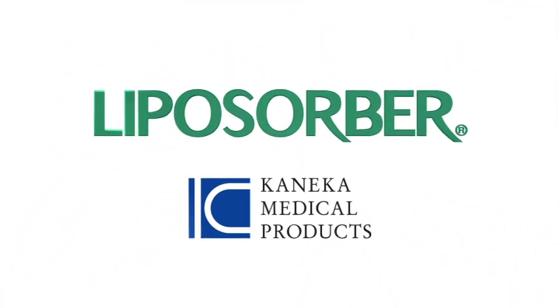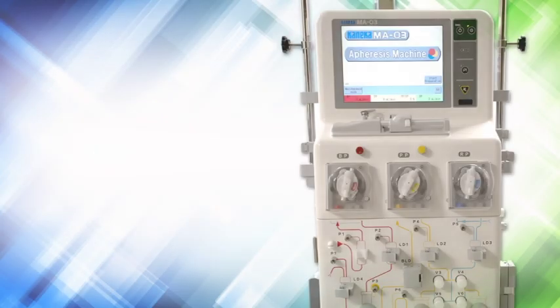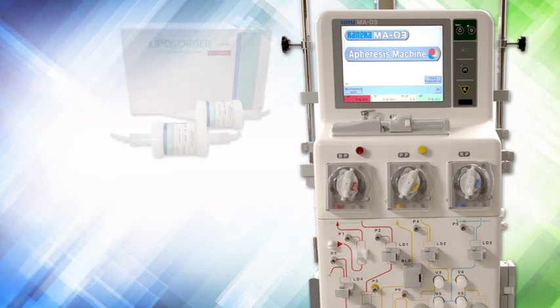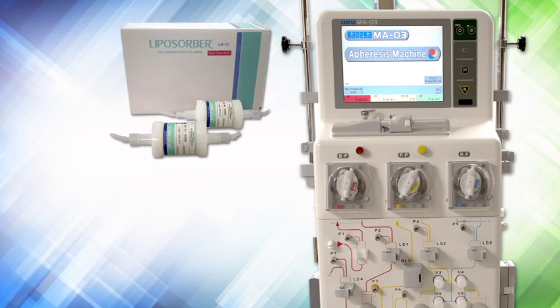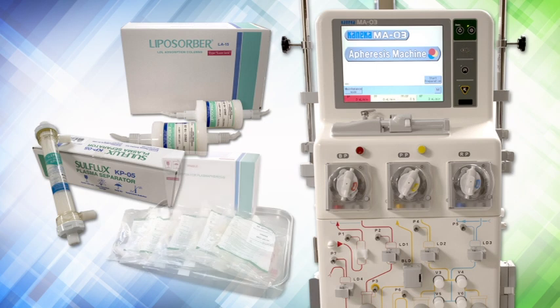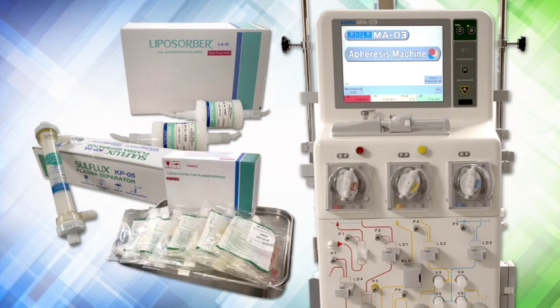The Liposorber LA-15 system is an integrated automated extracorporeal blood processing system comprised of the apheresis machine Kaneka MA-03, which controls and monitors the LDL apheresis procedure, and three single-use disposables: the Liposorber LA-15 LDL adsorption column set, which are two columns each containing 150 mL of dextran sulfate cellulose adsorbent, the Sulflux KP-05 plasma separator which contains polyethylene hollow fibers, and the tubing system for plasma apheresis NKM3R.